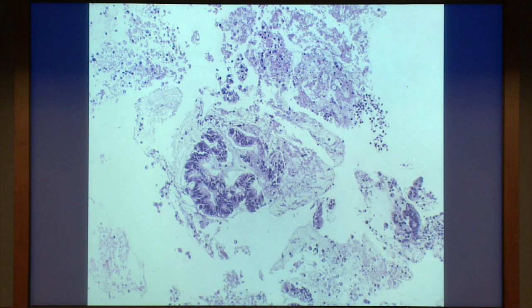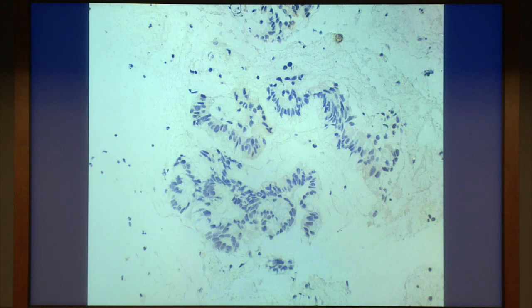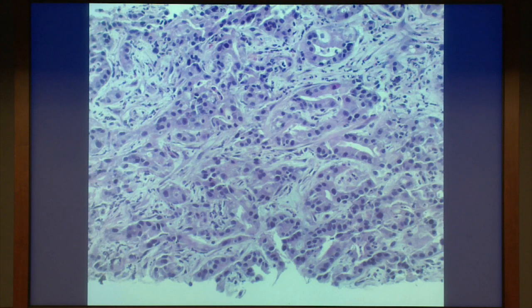However, in this particular trial, most of the specimens that I'm receiving to assess this stain are mostly metastases. And I'm finding that in the metastases, probably only about 25 to 30% of the samples are positive. So here's a metastatic biopsy. It happens to be negative, and that's what we're finding. So clearly it's different than the primary. And so if I happen to get the primary on a patient because their met hasn't been sampled, but it's been proven radiologically, the patient might be enrolled in the trial, whereas if their met had been sampled, they might not. So these are issues that can come up with a variety of markers, and at some point they have to be considered.